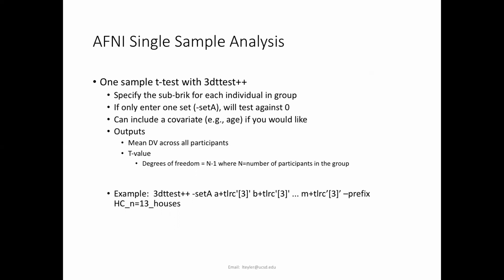So anyway, the first thing that you have to do in your command line, and in your assignment, which is off by a week, so the assignment for this is going to come out sometime next week. But in your assignment, I have the link to the help file, but you can look on AFNI at the help file for 3dttest++, and it gives you lots of information, more than you ever really want. But basically, you have to specify which sub-brick for each person.